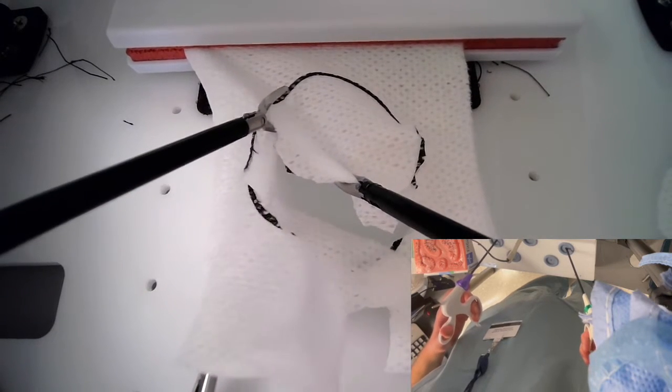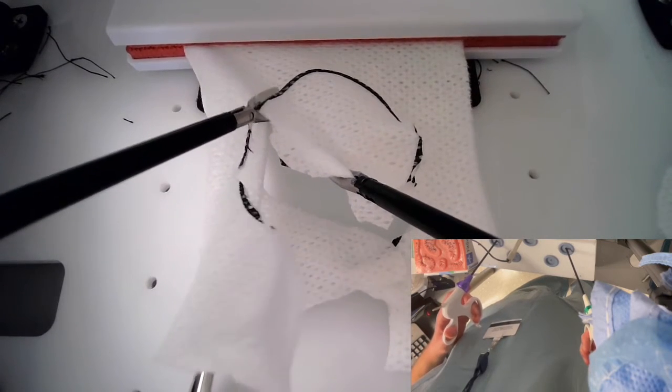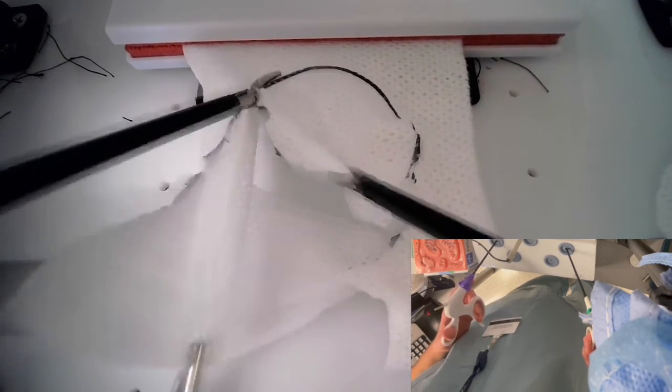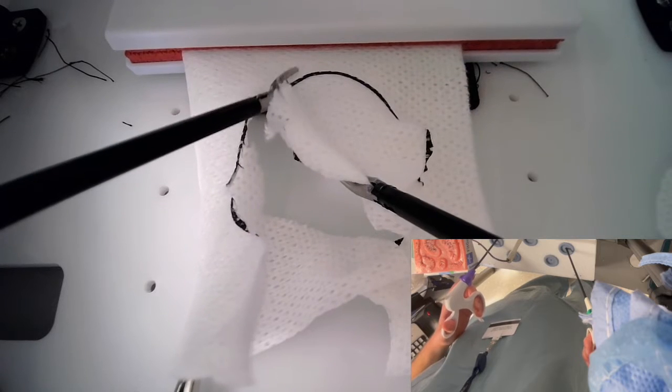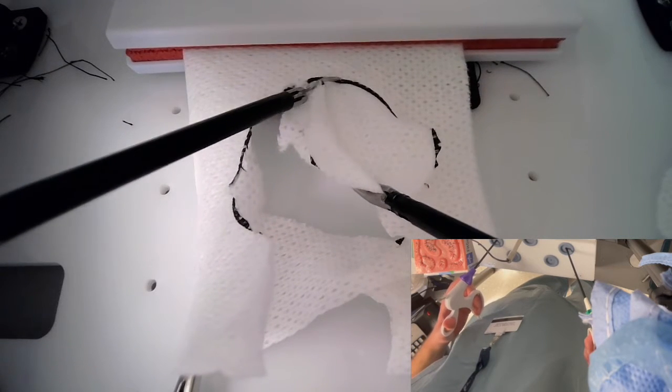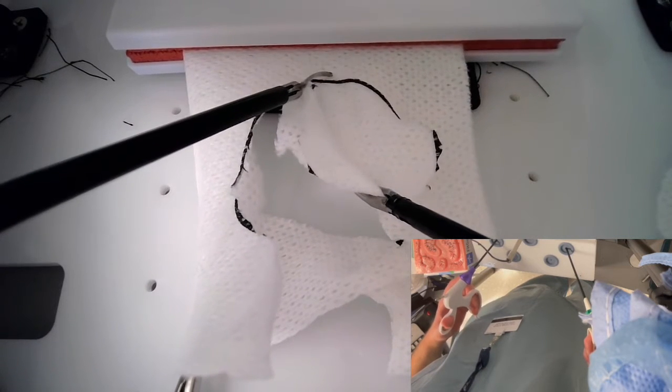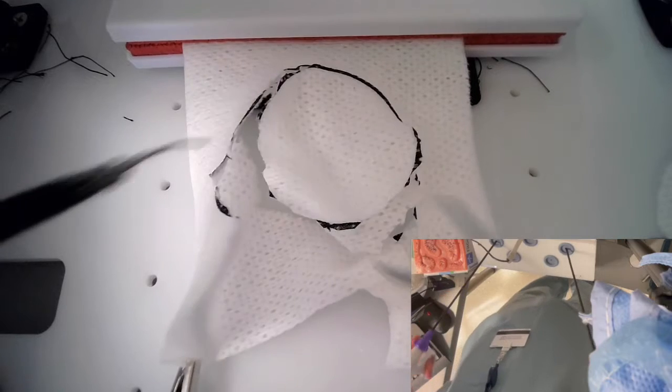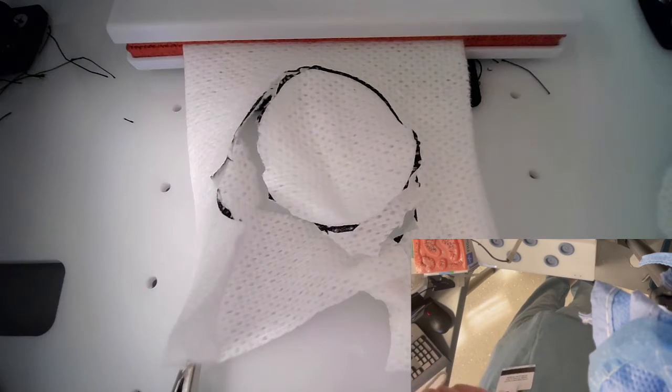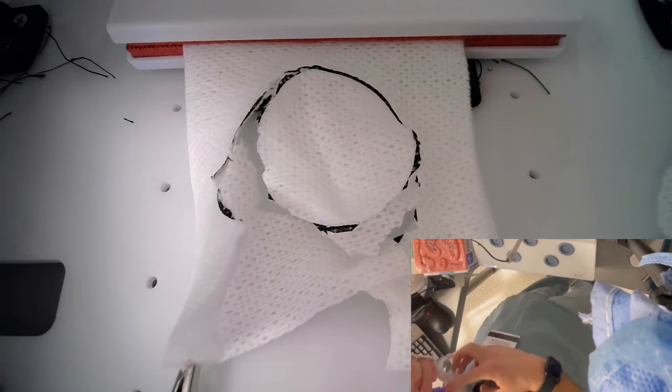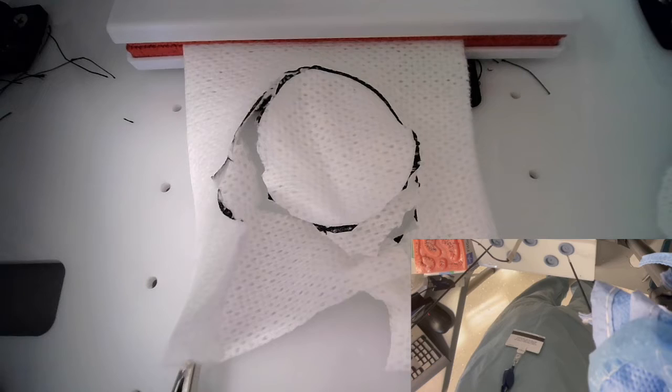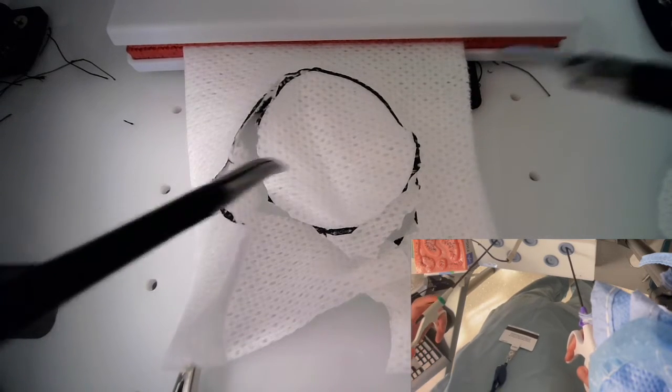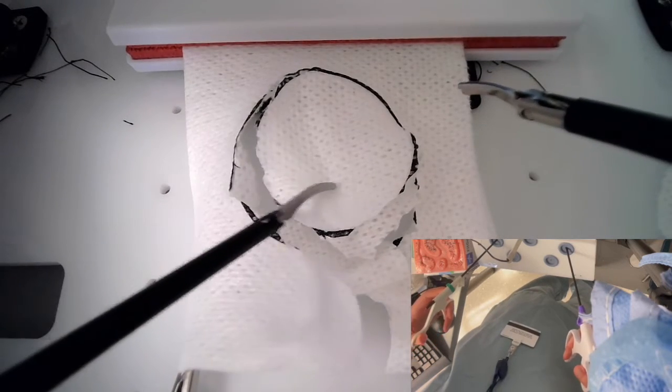You always want to be cutting in the direction where your hand is pointing—it's always a little bit more convenient for you. Exchanging instruments takes a bit of extra time, but I think it's worth it as a nice modification of this exercise when most people are using primarily their right hand.